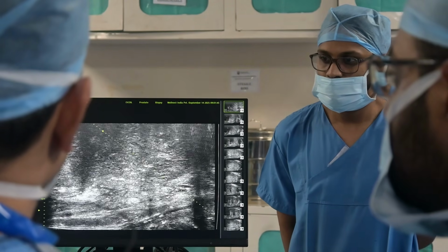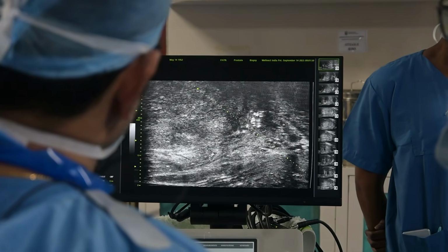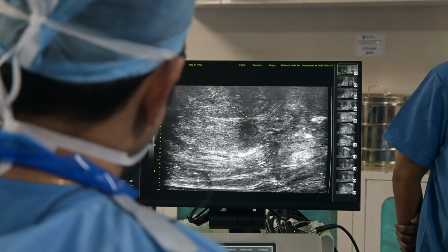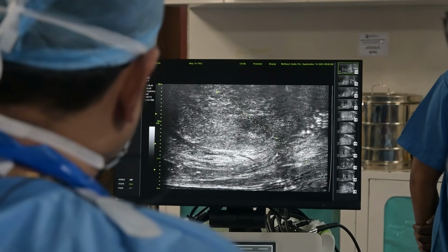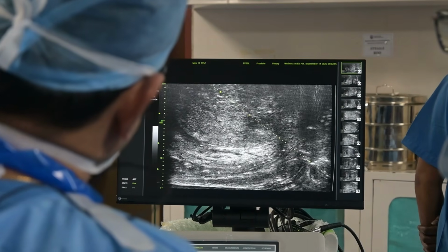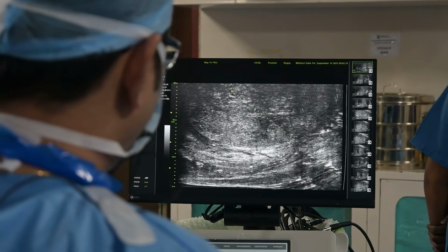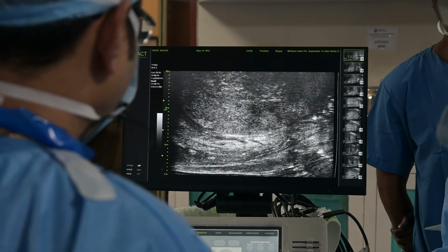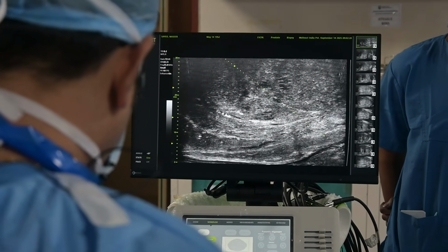So, you see this calcification at the apex. This is the starry sky appearance. So, this corresponds to PRIMUS 4 actually. But to answer your question, if there is a calcification between the peripheral zone and the transitional zone, that calcification you can see, but the acoustic shadowing is not terrible. The diagnostic value in the ultrasound is with the calcified. Yes, sir. This is one of the diagnostic features.